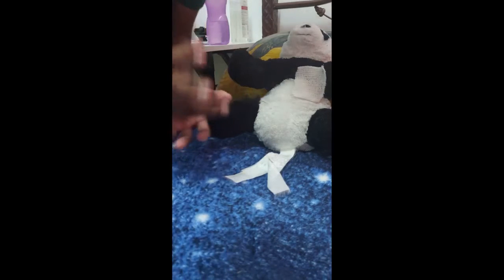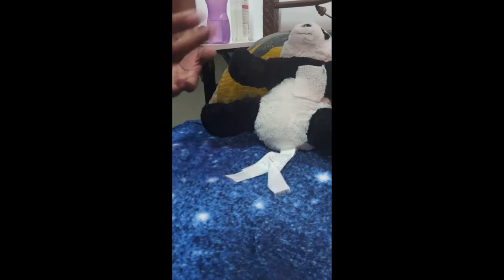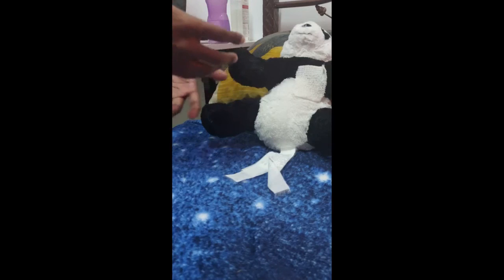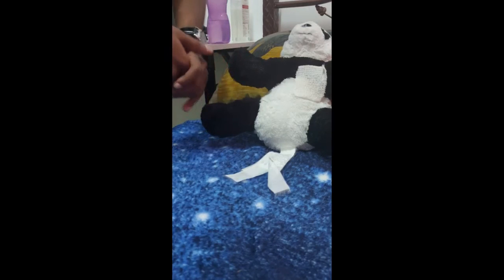Last but not least, you will have to keep any cellular devices or anything like microwaves or any electrical items that may release waves away, as they could disrupt the function of the pacemaker. So those are the steps that you have to observe in a patient that has a pacemaker implant surgery.